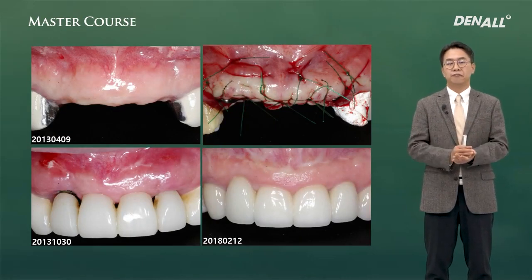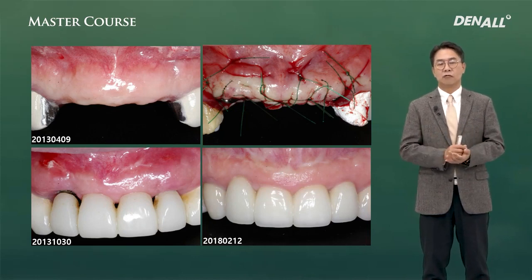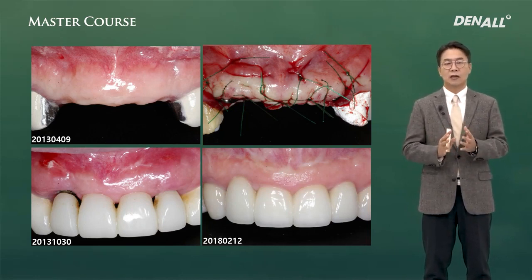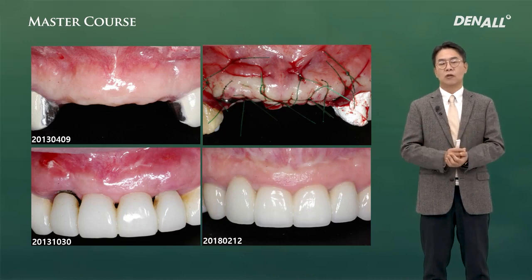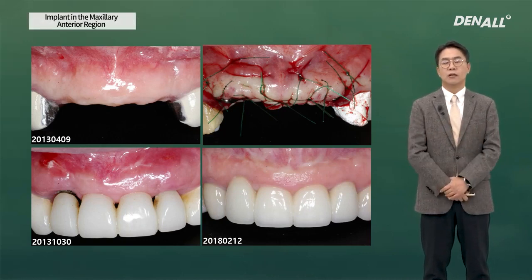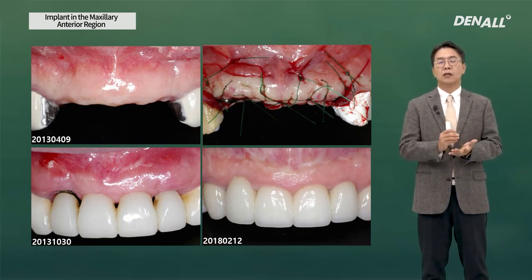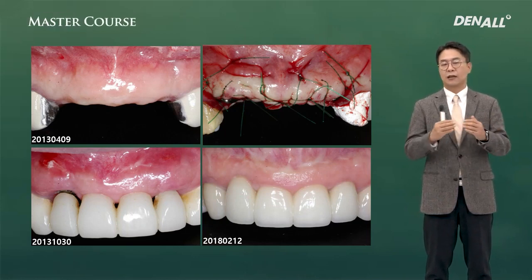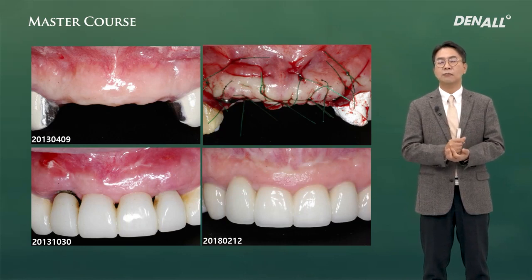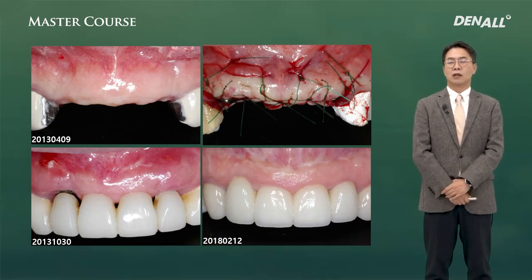Here you can see a lot of tooth loss in the upper anterior. Soft tissue and hard tissue status was checked and implants were placed. If you look at it here, the contour is dramatically changed. A temporary prosthesis was used before final prosthesis, and the position of number 2 compared to the original plan is type 2 gingival line, the aesthetic line, which was explained before, but overall the prosthesis looks okay.